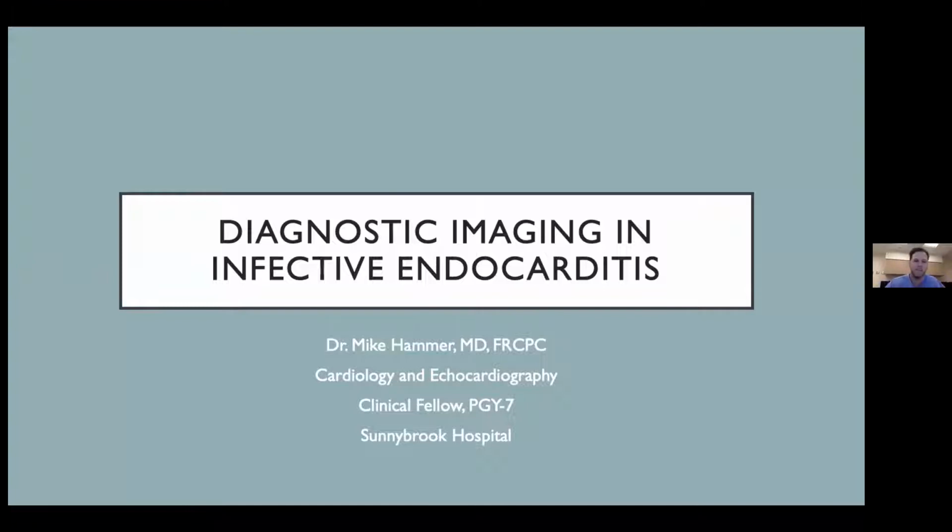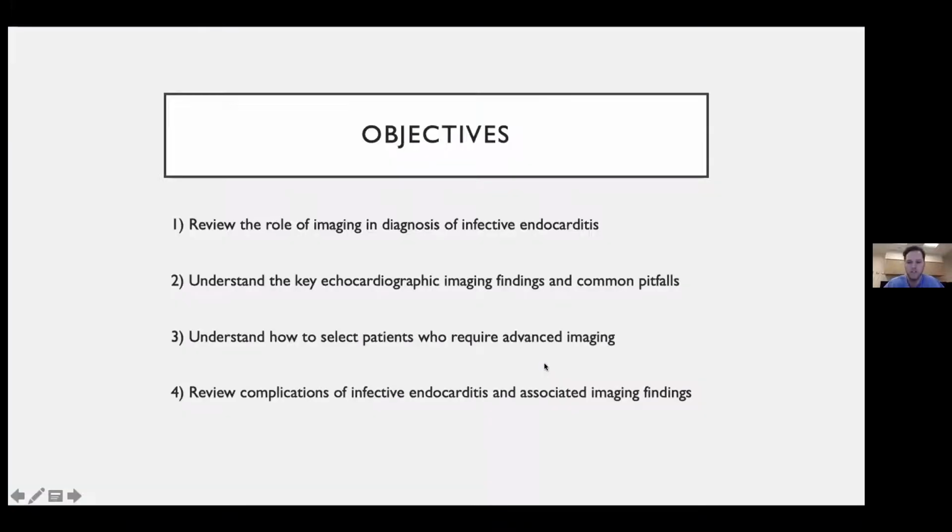So I'm going to talk today about diagnostic imaging in infective endocarditis. So, okay, I'd like to start by discussing where imaging fits in the diagnosis of endocarditis.